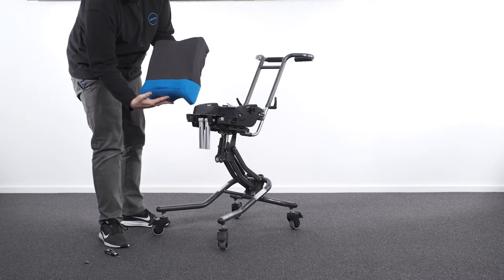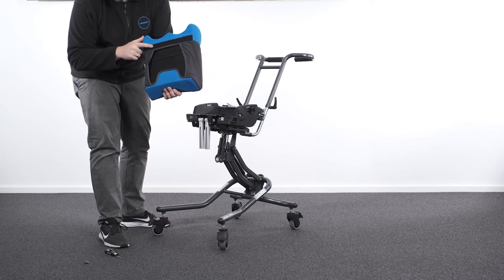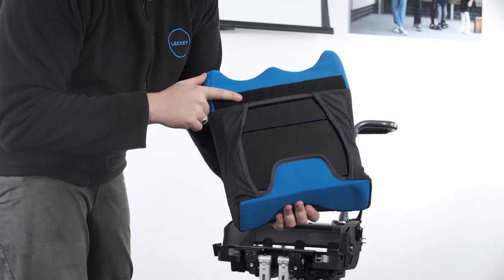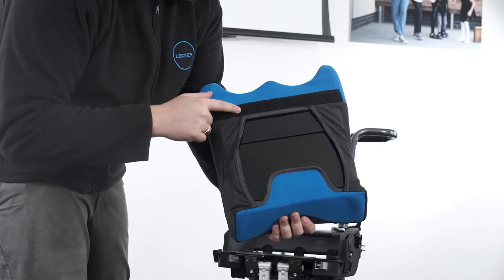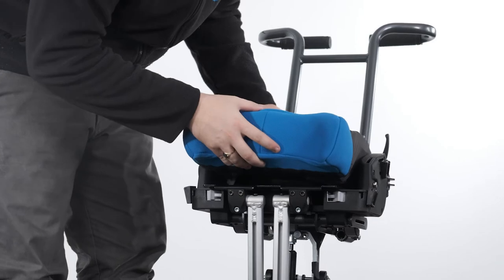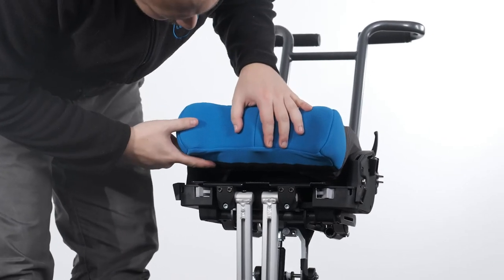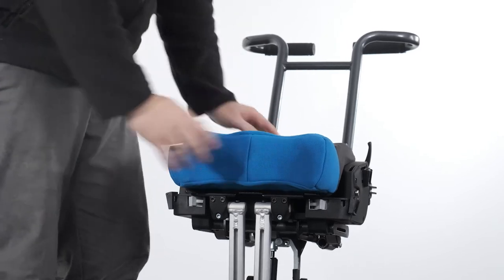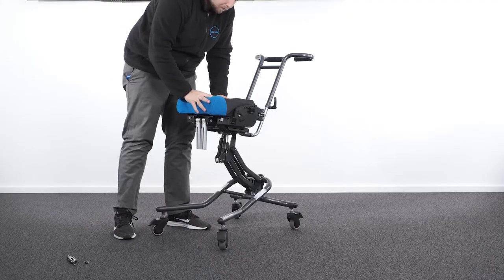Attaching the contoured seat. The contoured cushion assembly is secured to the seat plate using velcro, located on the underside of the contoured cushion assembly and the top surface of the seat plate. To attach the contoured seat to the seat base, align the front of the seat base platework with the front of the contoured seat foam and press down to secure the velcro.